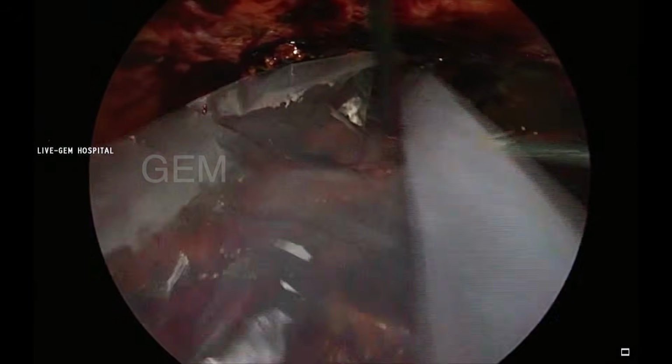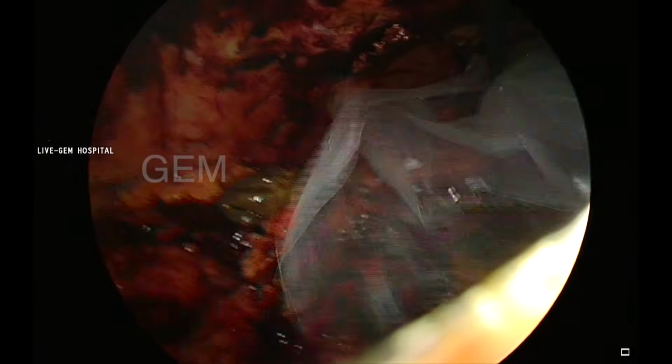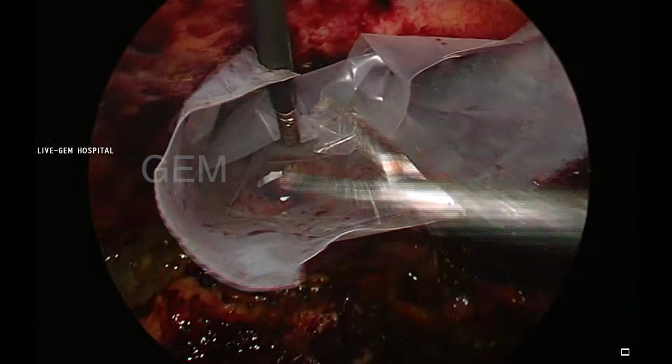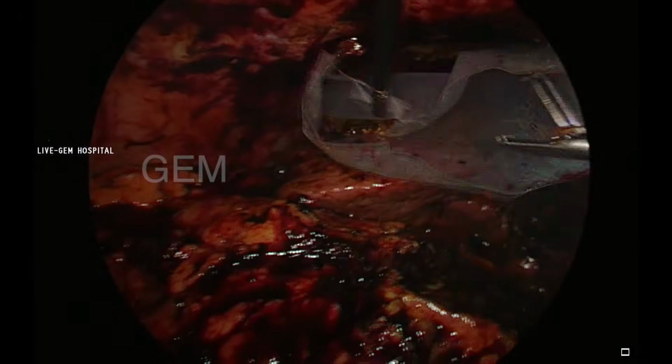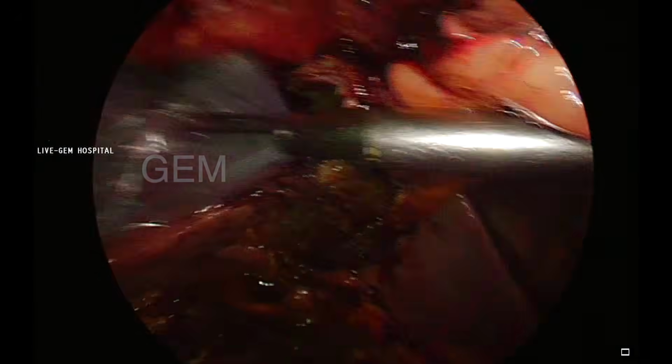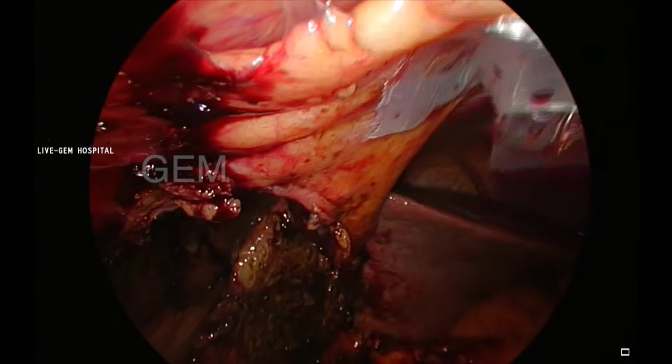The excised gangrenous gallbladder is being placed into the endo bag. So that is the mucosectomy, and the excess infundibulum got trimmed. Now it's placed into the bag and then I'm taking it out.